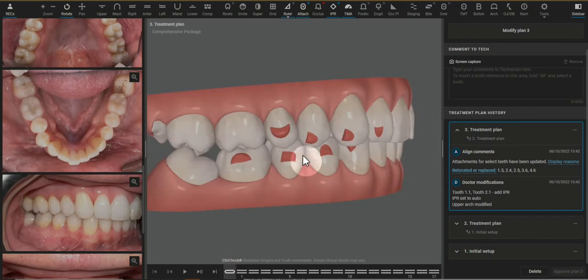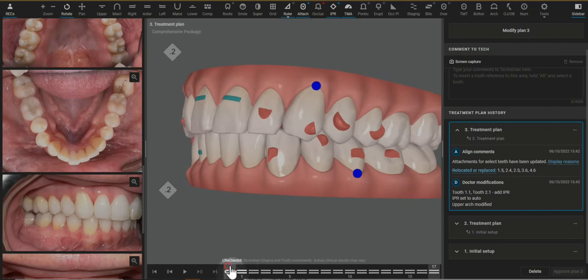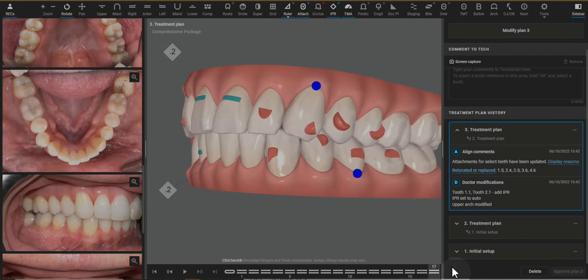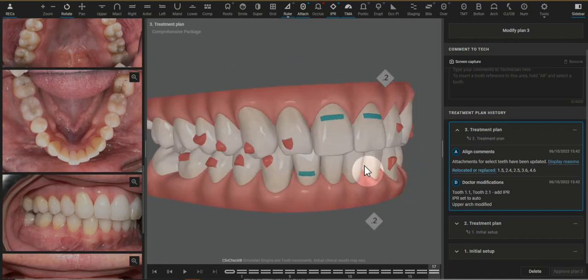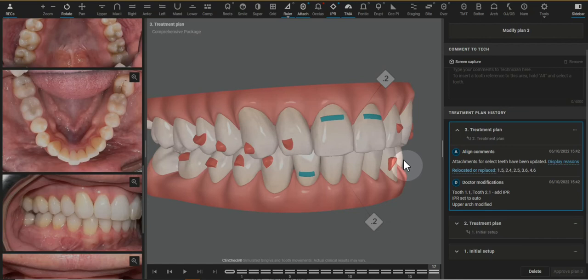Looking from the posterior forward, I see close to class one molars. I see that the first molars are doing some expansion. It looks like it's more pure translation to the buccal than anything and I'd rather do molar uprighting. I'll show that with the 3D controls in a moment.